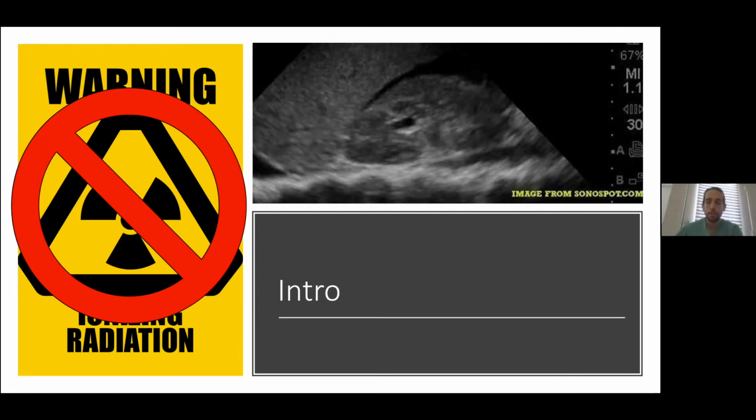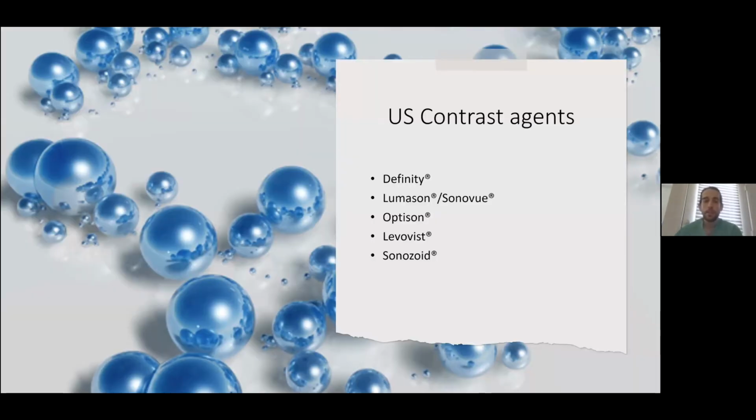It does have some benefits though. Ultrasound was really helpful in pregnancy and children, where you want to try and avoid the radiation. But due to those limitations of the non-contrast enhanced exam, we have developed some contrast agents that have started to be used for contrast enhanced ultrasound in trauma.